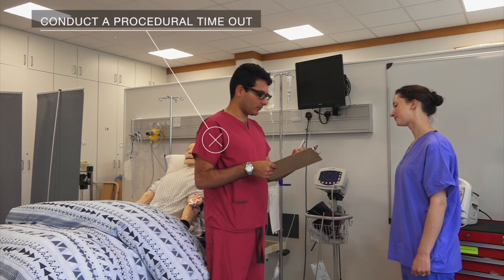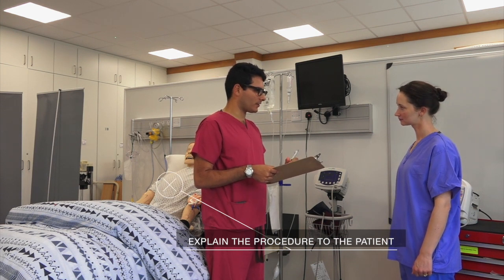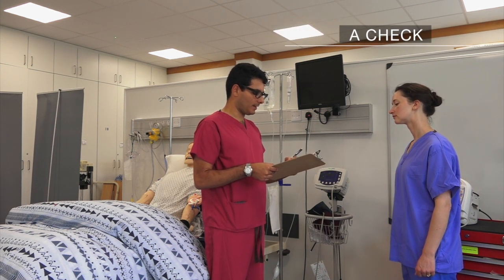Begin by conducting a procedural timeout. If the patient is awake, explain the procedure. Then use a checklist to review indications and contraindications for the procedure and relevant information.